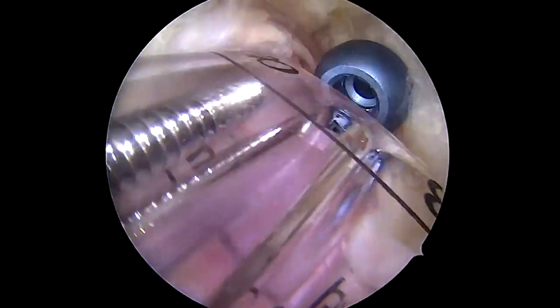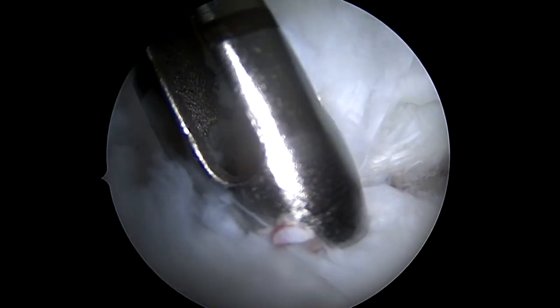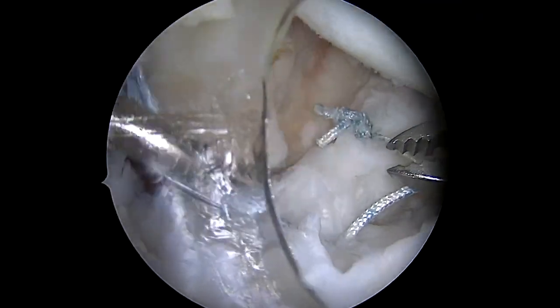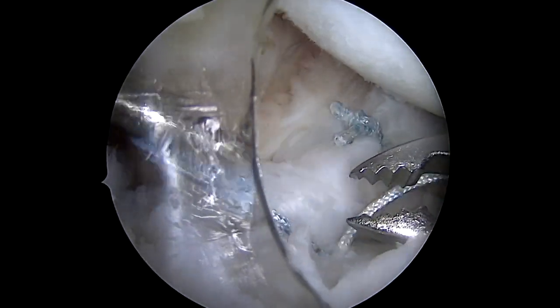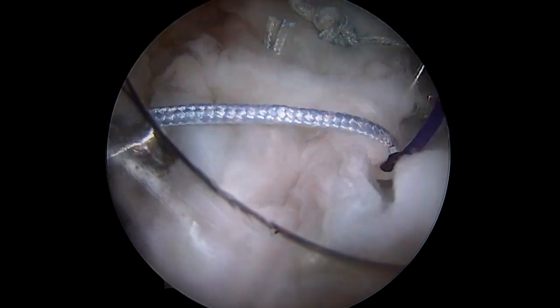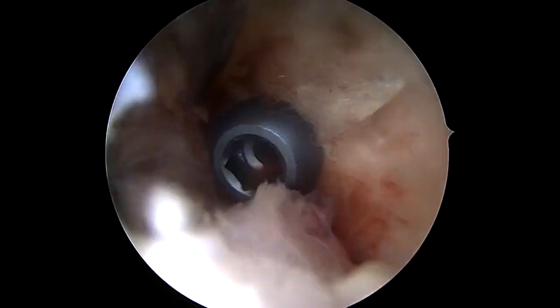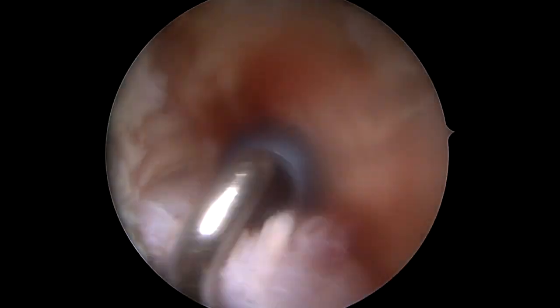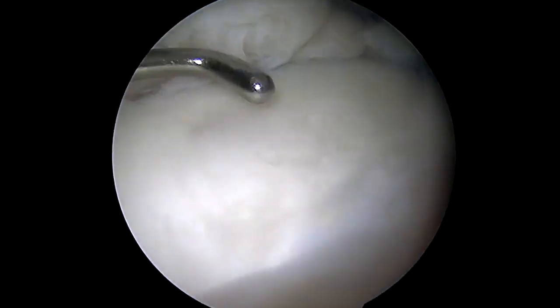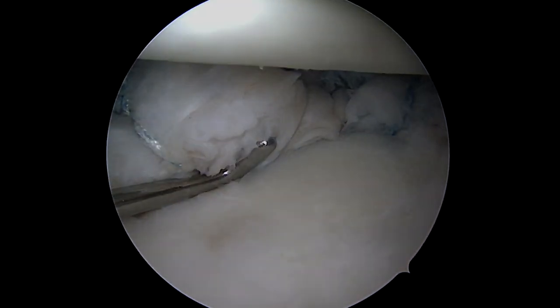There's our screw on the fragment down on the anterior glenoid neck, and here's placement of one anchor above the piece — a total of four anchors and one screw to get that piece exactly where it's supposed to go. It can be very challenging to fix these large glenoid fragments, but placing a screw gives you more confidence that the piece is solidly fixated. It's a nice technique for a piece that's big enough, and you can see really solid fixation with both the soft tissue and the fragment itself.